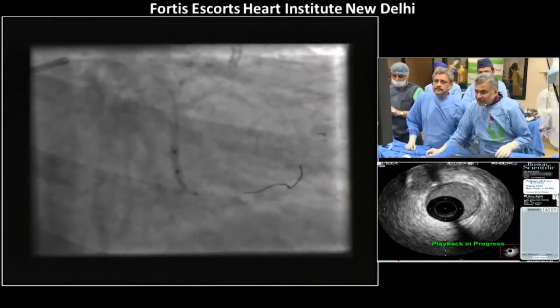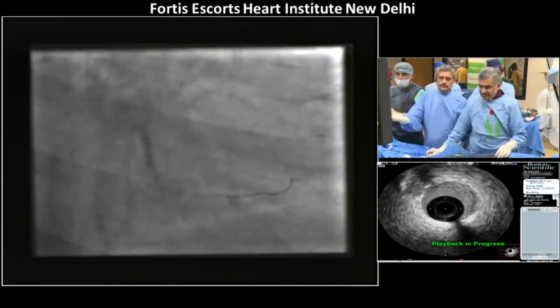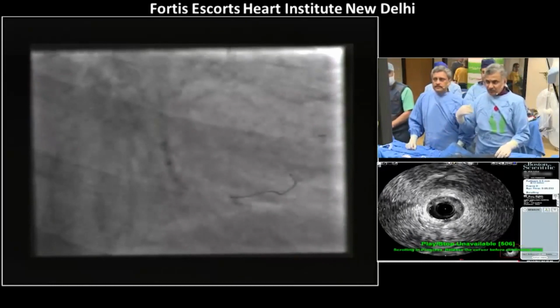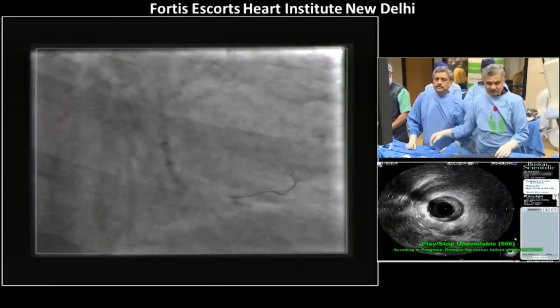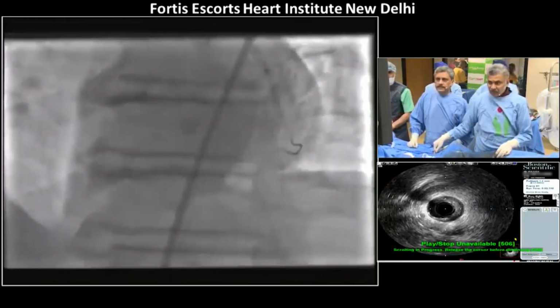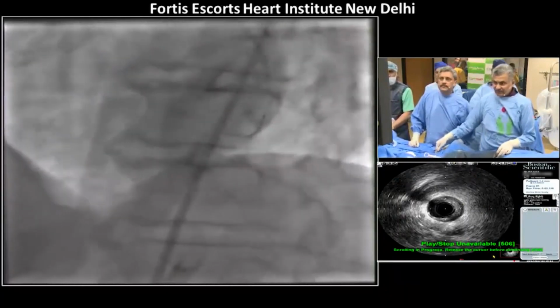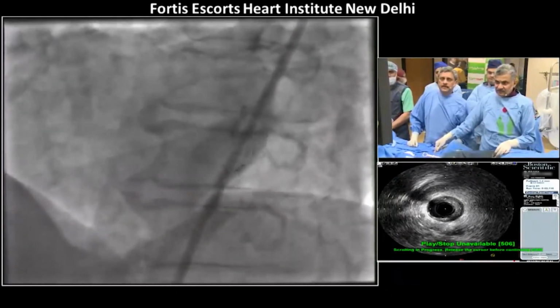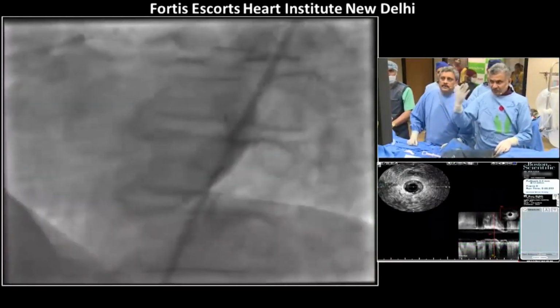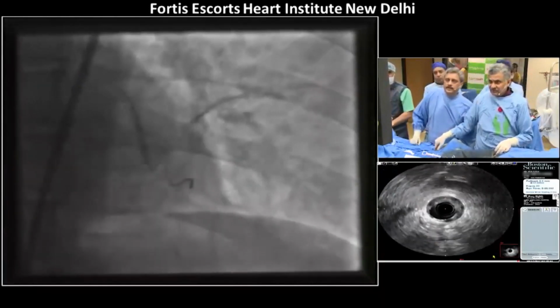28 and a half, 29. Another view. Yes. Should we take another caudal view? Go to a cranial. My other option would have been to come back a millimeter and keep the balloon higher, in center. Yeah. Now I think we won't go any further high. Go more. Okay. Come back to this side. Come back. High. More. Yeah, more. That's it. Stay here. Let's have a center.